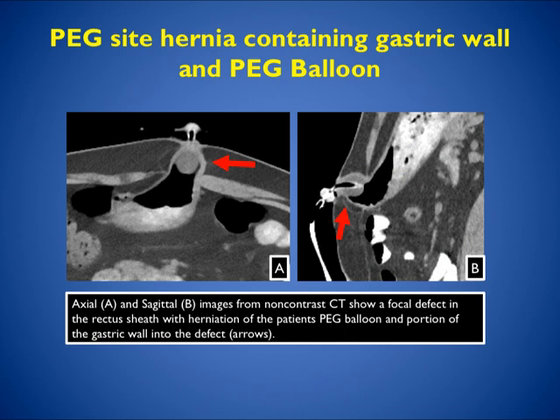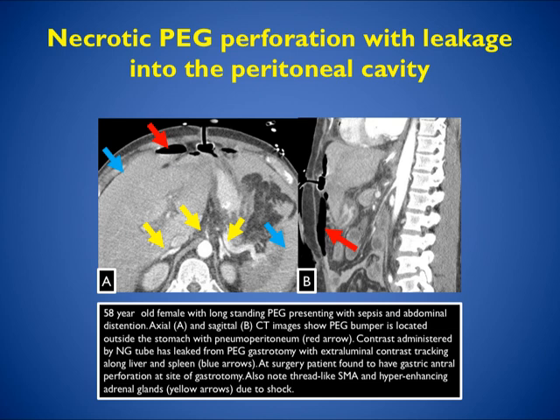Here's an example of a PEG site hernia containing gastric wall and the PEG balloon, in a patient who has had the PEG in for a long time — it has simply worn its way out anteriorly. In another case, the patient has perforation with leakage into the peritoneal cavity, areas of necrosis, and infection. Note how bright the adrenals are and how small the celiac and SMA appear, indicating the patient is hypotensive. At surgery, the patient was found to have gastric antral perforation at the gastrostomy site.